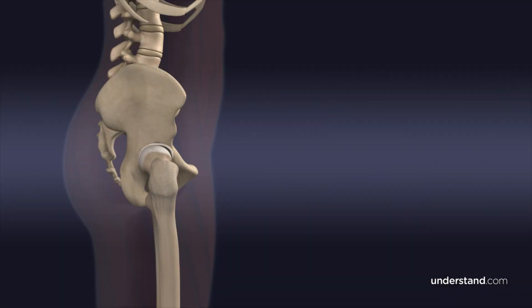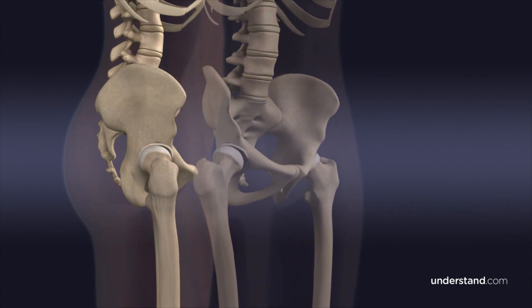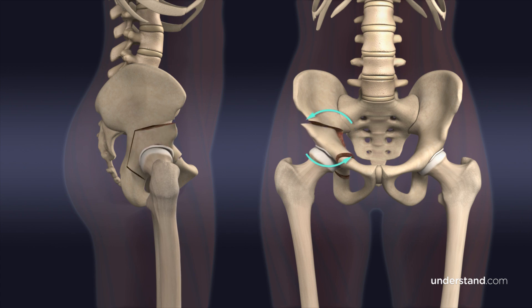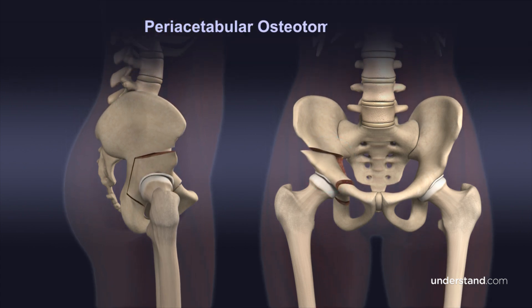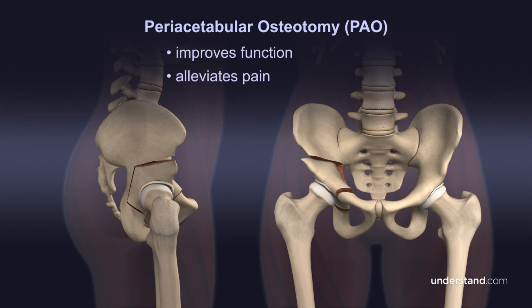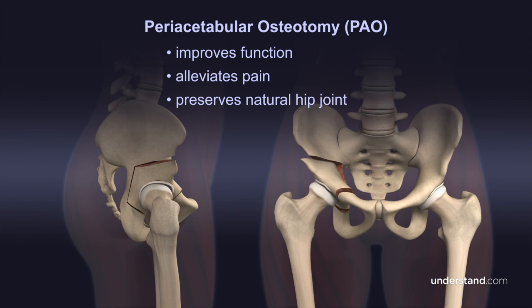A surgical procedure known as periacetabular osteotomy, or PAO, corrects acetabular dysplasia by carefully cutting the acetabulum from the pelvic bone and repositioning it so that the femoral head will be supported and fit deeper in the hip socket. The procedure aims to improve function, alleviate pain, and delay or prevent osteoarthritis. Additionally, a PAO preserves the natural hip joint, postponing or eliminating the need for a total hip replacement. The procedure is tailored to an individual's specific anatomy to achieve the desired result.